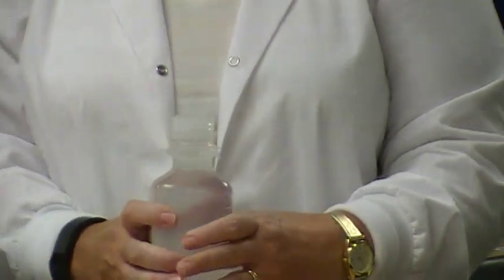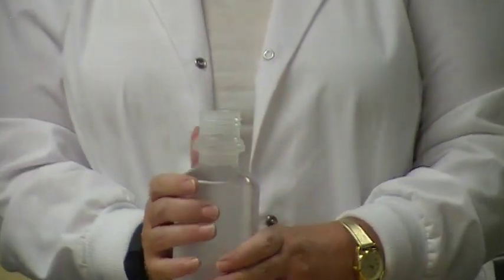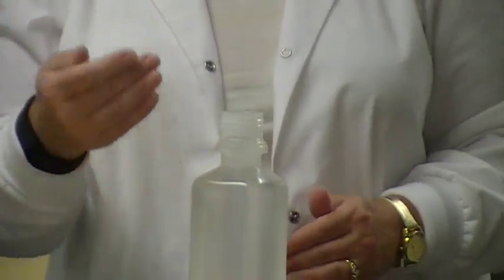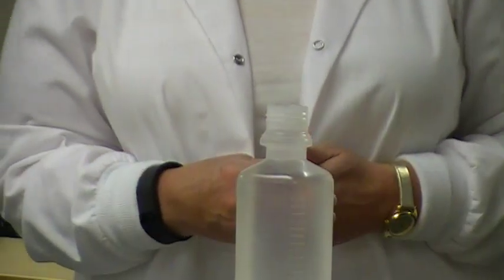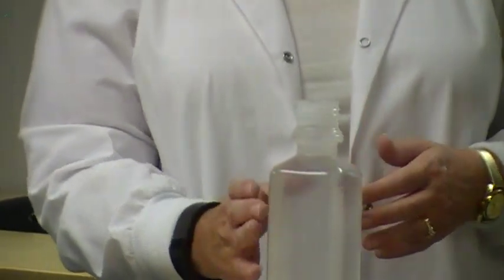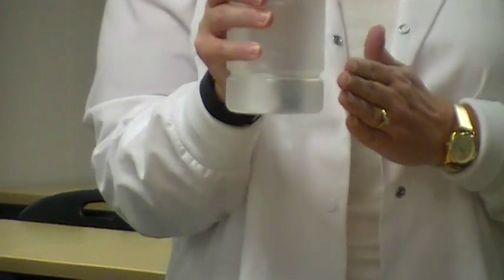This goes for any liquid that you ever pour, whether it's a medication or a solution. The reason being is when you hold that label in your hand, that prevents liquids from running down into that label where you can't read it. Anytime you can't read a label, then you don't need to use it because you're not for sure what's in that container. So you're holding the label against the palm of your hand, so it's facing the palm of your hand.